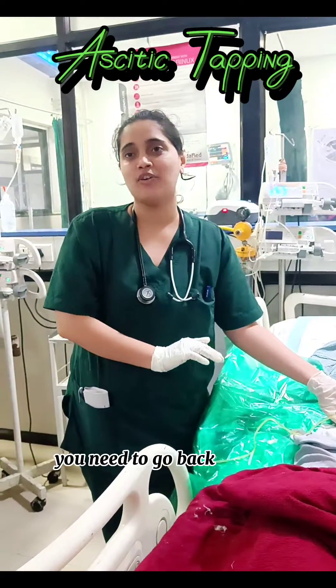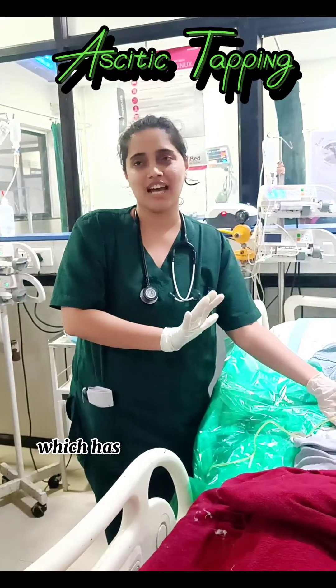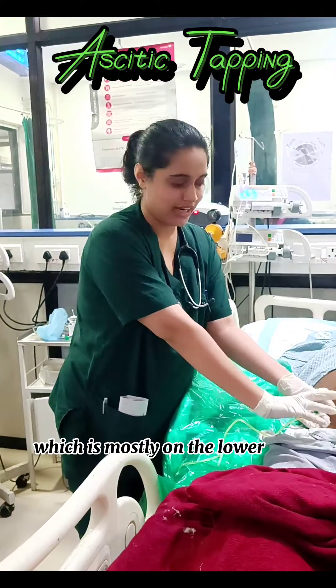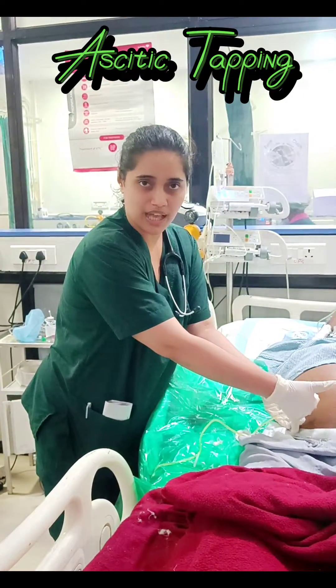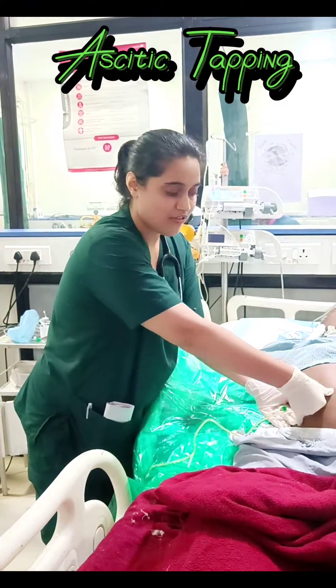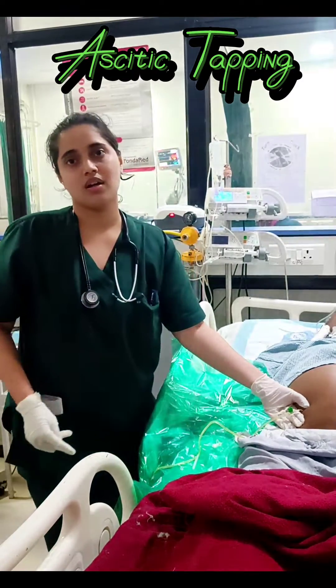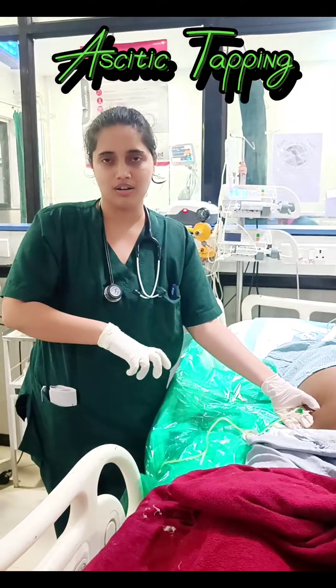Before we do that, we need to know where to prick. We need to find the spot which has the most fluid — the tense abdomen — which is mostly on the lower end of the abdomen. Find the distance between the anterior superior iliac spine and the umbilicus. Find the area which is the most tense, and there you have to put your syringe or your cannula.